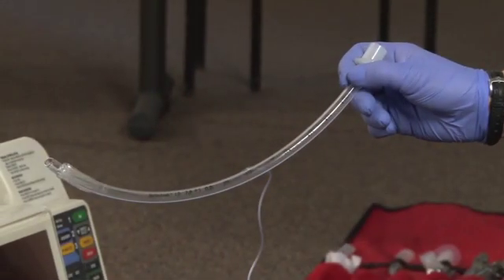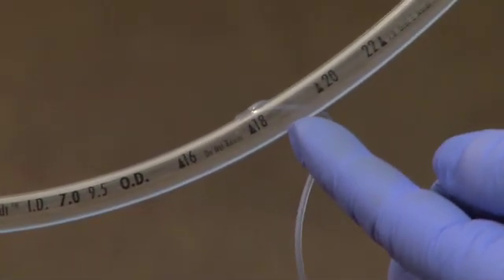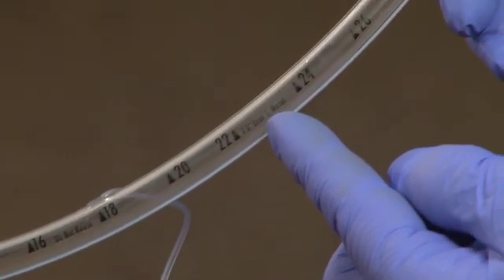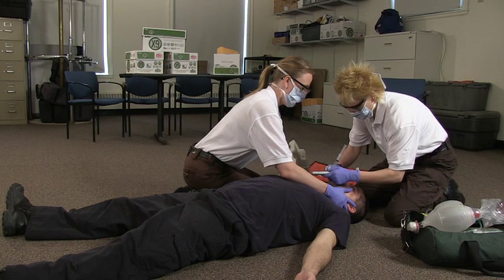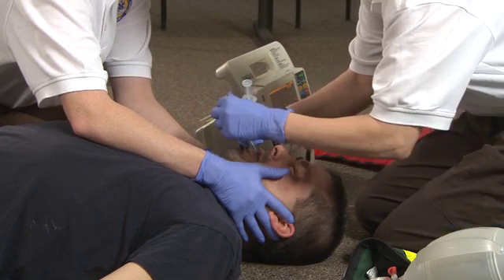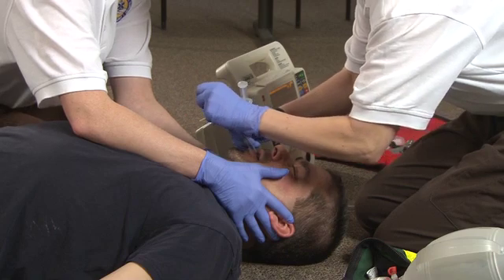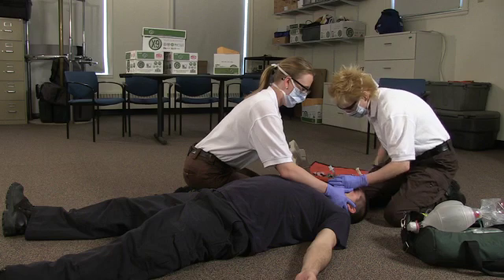The markings on the endotracheal tube indicate the proper depth of insertion, which is usually 21 centimeters for the average adult female and 23 centimeters for the average adult male. The provider holds the endotracheal tube in place and removes the laryngoscope blade. The provider removes the stylet, if a stylet was used in the endotracheal tube, and then attaches the syringe and inflates the cuff with 5 to 10 milliliters of air.